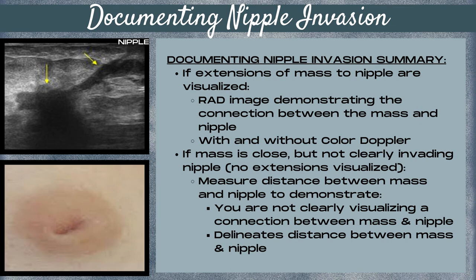If the mass is close to the nipple but not clearly invading it — meaning you don't see any visible extensions — then you want to measure the distance between the mass and the nipple. This demonstrates that you're not clearly visualizing a connection and delineates that distance. Some sites will want a measurement of the distance from the nipple regardless of whether extensions are seen, so it's important to follow the protocol of your site.